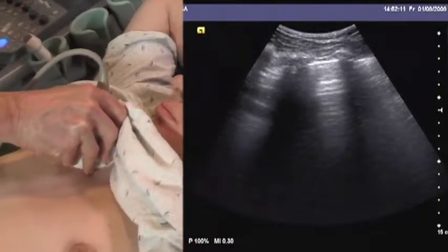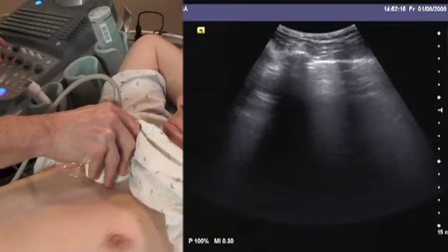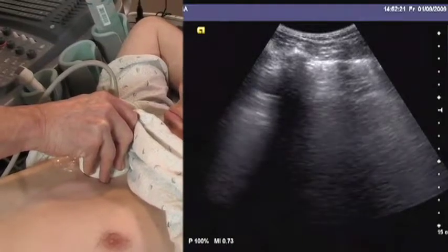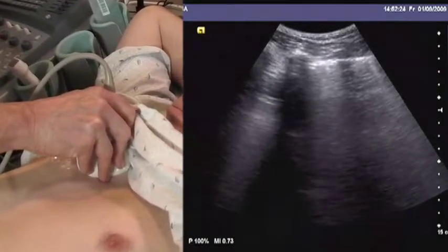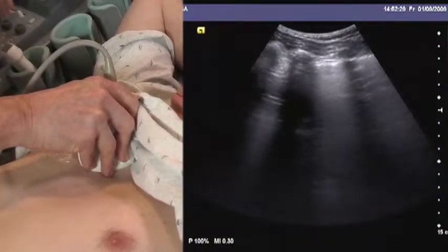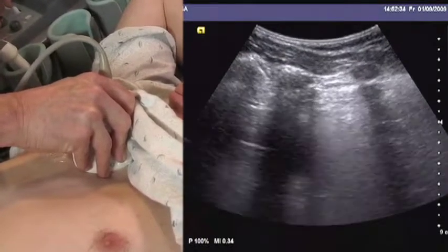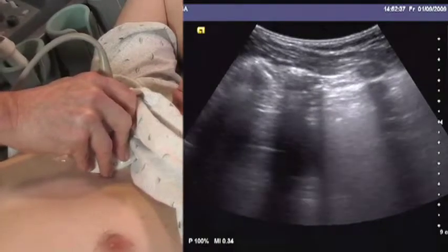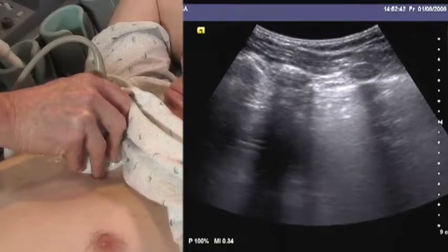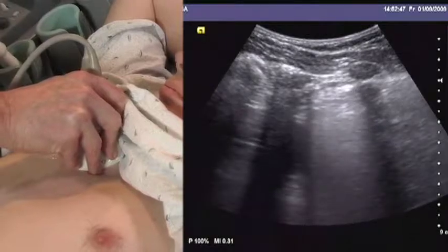The depth is relatively great after the abdominal FAST exam, so adjustments of depth and frequency need to be made. We increase our frequency since it was fairly low, and adjust depth to a more superficial location, because even in the heaviest patients the pleura in the thorax is less than five centimeters deep. We'll adjust our focus to a superficial level and put the gain fairly low.